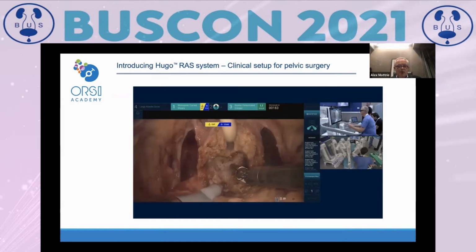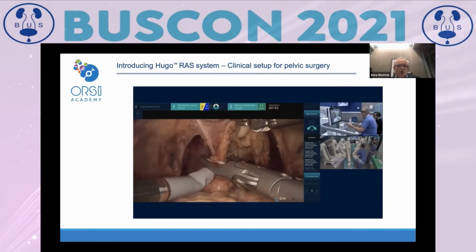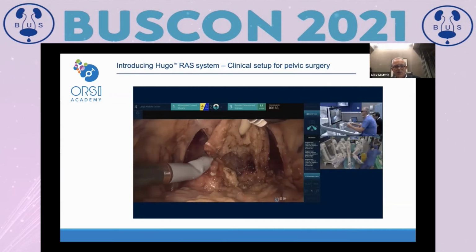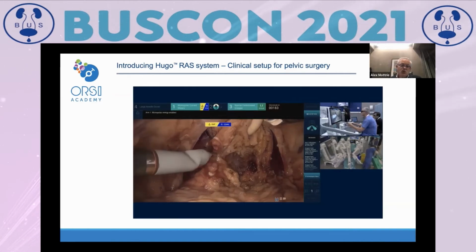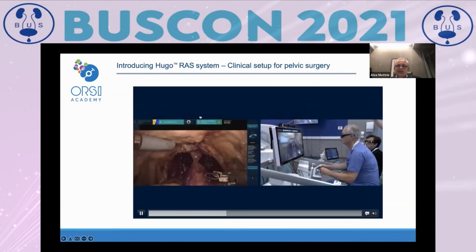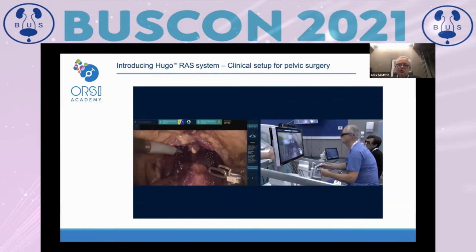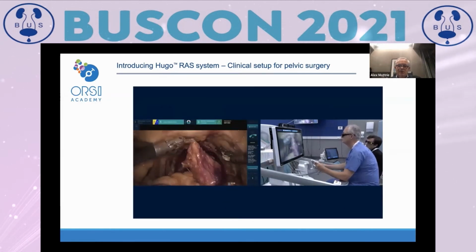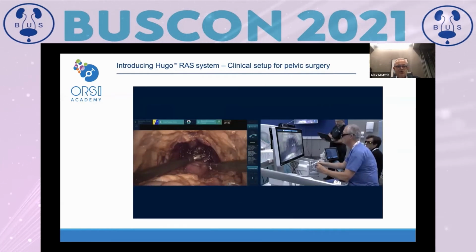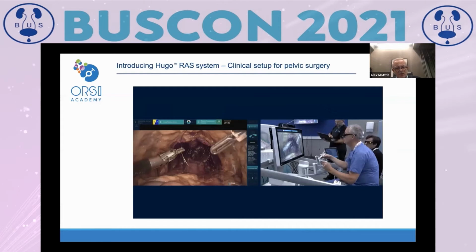We have now cut through the bladder neck. We are now going through the prostatovesical musculature to go for the seminal vesicles and the vas deferens. And now we are going towards the left lateral side, where we want to do a nerve spare. Here you see that the ergonomics of the surgeon is also very important. You can put your elbows very conveniently. That pistol is very easy to use. So I must say that the ergonomics for the surgeons is an important part. And here you see us do, I believe, the anastomosis.